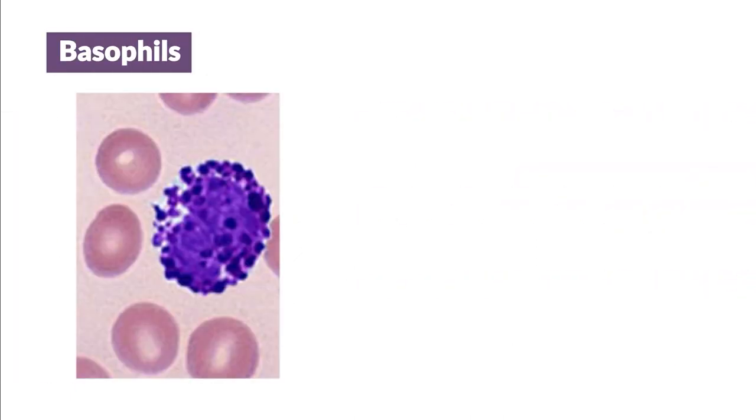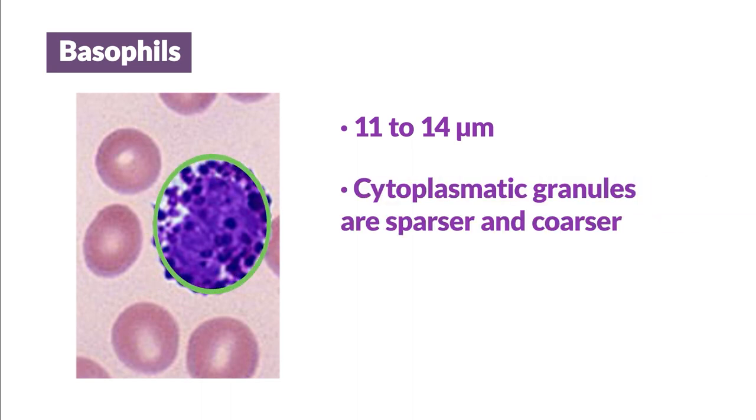Basophils. Basophils are also similar in size to the other granulocytes. Their diameter ranges between 11 and 14 micrometers. In this case, the cytoplasmic granulations are sparser but coarser. As the name suggests, they are stained with basic dyes and have a dark blue or black coloration.